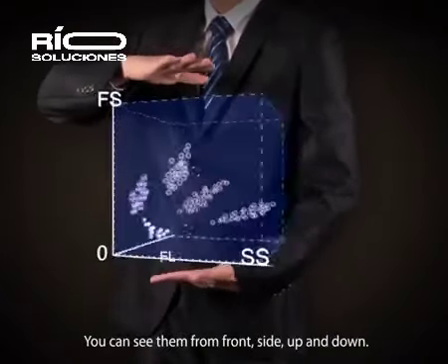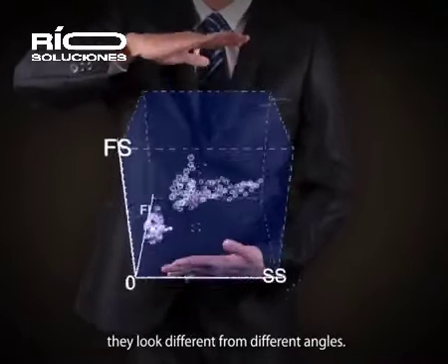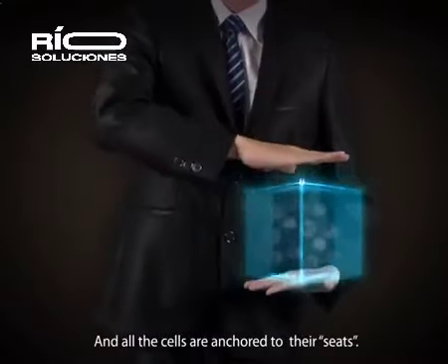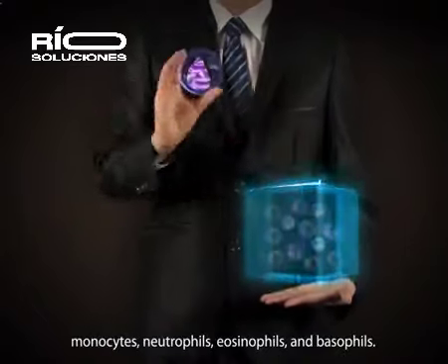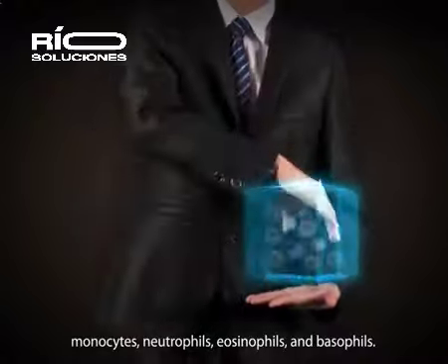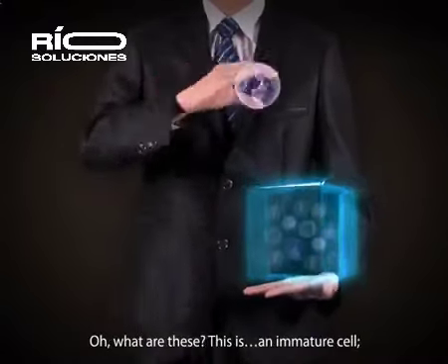You can see them from the front, side, up, and down. They look different from different angles, and all the cells are anchored to their seats. Let's see, we have lymphocytes, monocytes, neutrophils, eosinophils, and basophils.